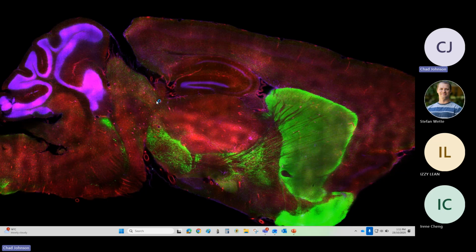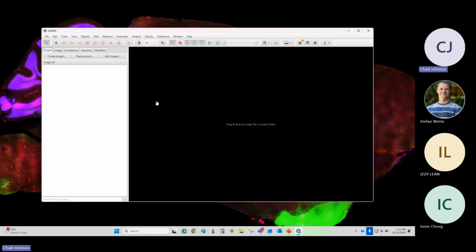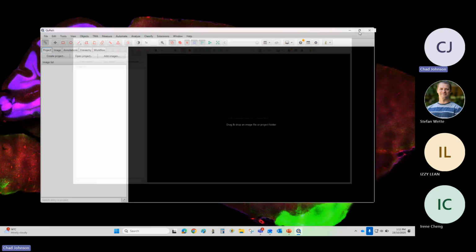The QuPath console allows you to use other functionality using the command line. I'm not of that level to be able to use that functionality, but using just QuPath as is, it is usually perfectly fine.